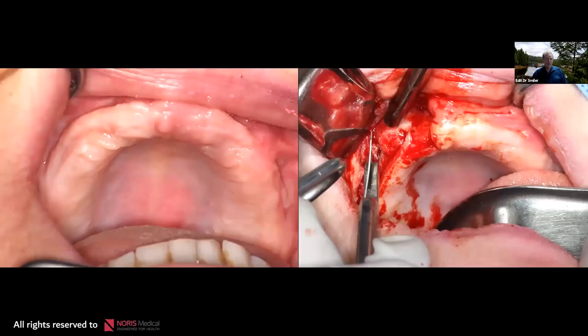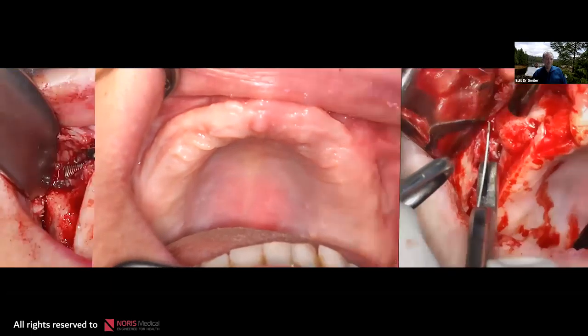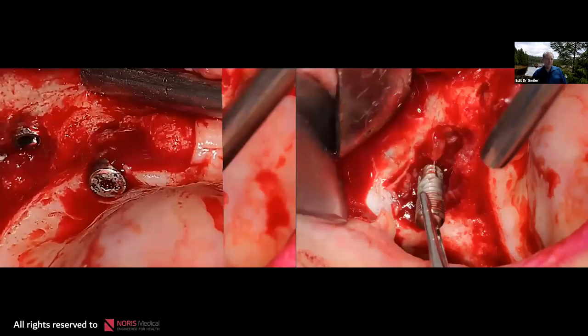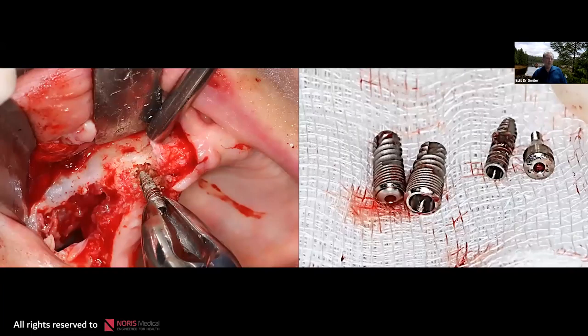We made a crestal midline incision with vertical relaxing incisions posteriorly. Elevating the flap, we see the malar buttress and open into the sinus, where the implants are dislodged into the antrum. The first thing to do is take out those implants. There is a lot of granulation tissue and inflammatory tissue here, so we enucleate those tissues, debride the area, clean it as much as possible, and perform copious irrigation.